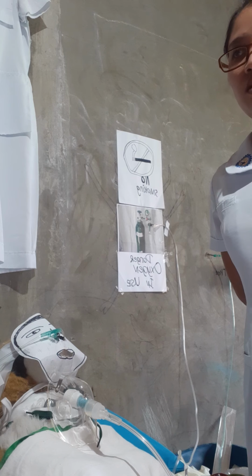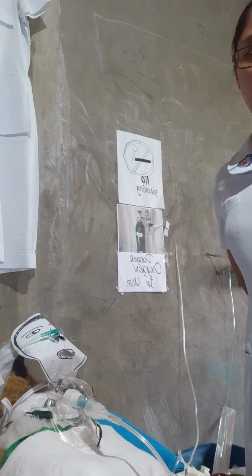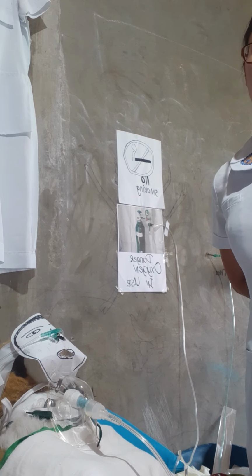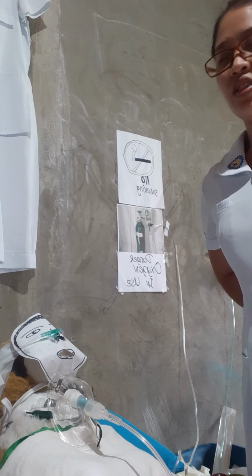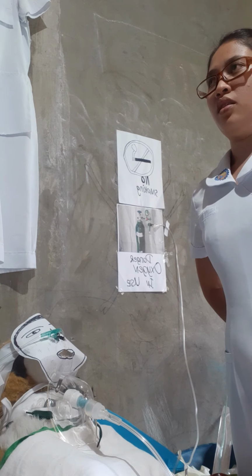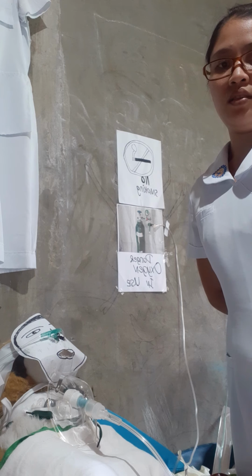Then afterwards, after the procedure, the vital signs of the patient: the pulse is 75, the blood pressure is 135 over 75, the respiratory rate is 16, and the temperature is 99.0, and the oxygen saturation level is 97%, and there are no crackles when auscultated, and just a small amount of white oropharyngeal secretions removed when suctioning.